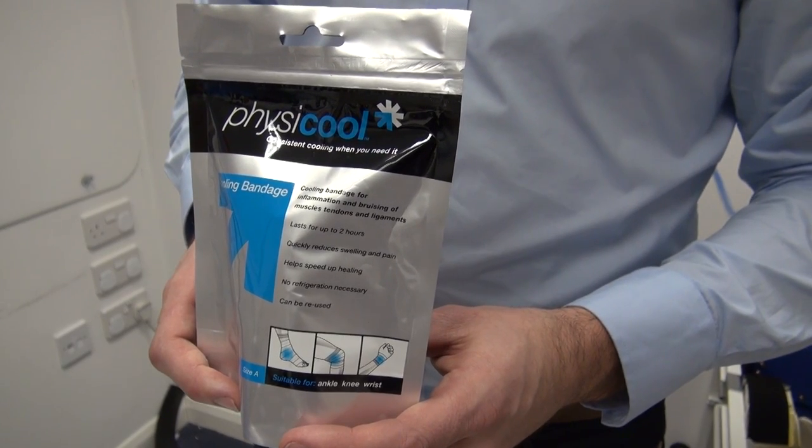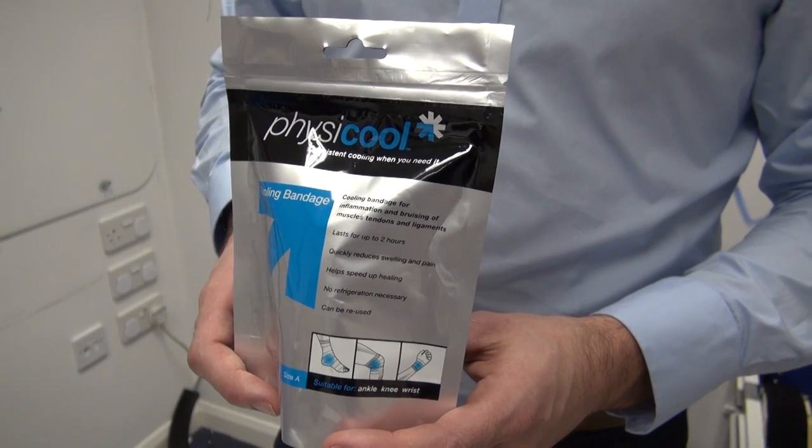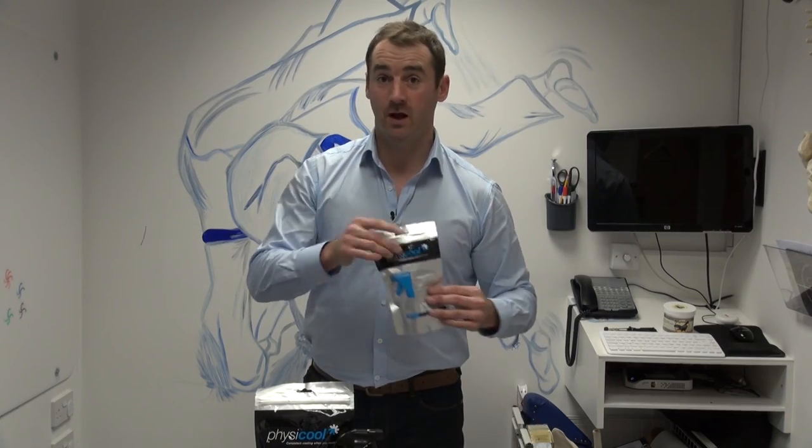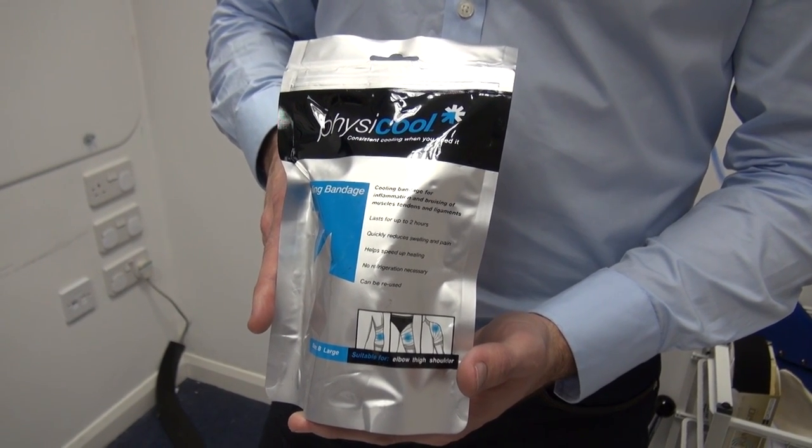The bandages come in two sizes. Size A, used to reduce swelling and inflammation in ankles, wrists and elbows. And size B, which is larger, used for knee, thigh, calf, back and shoulder injuries.